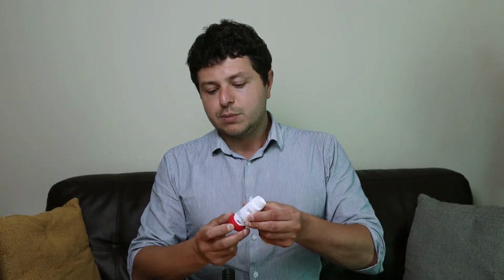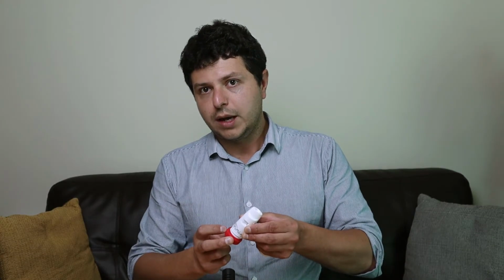I need to arm the device again. And then I'll explain things as I go. So it went click again. I hope you heard that click. So now it's ready to go. I know that it's ready to go.